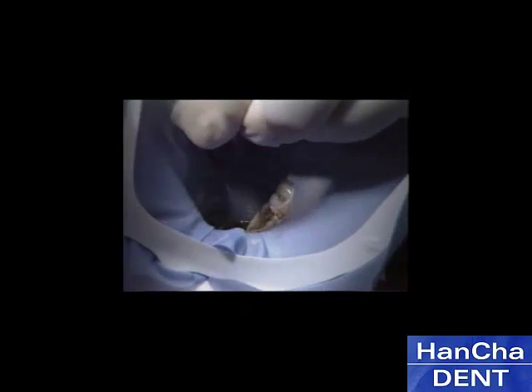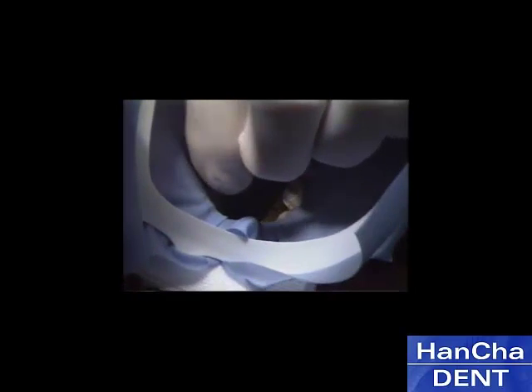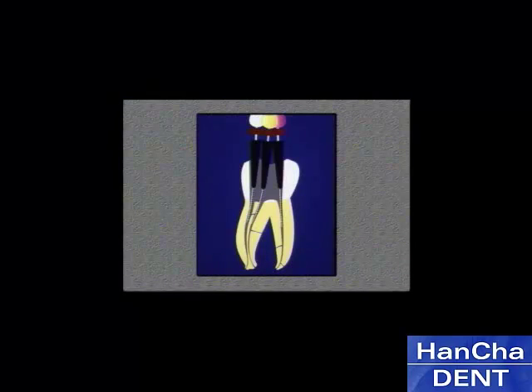The prepared files are inserted well into the body of each canal. It is generally advisable to use a different sized file for each orifice so as to be able to differentiate which file represents which orifice as the procedure develops.